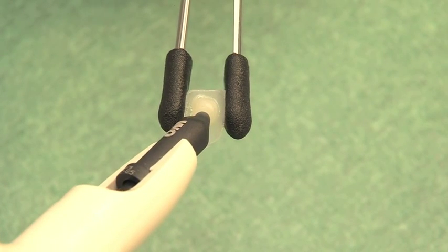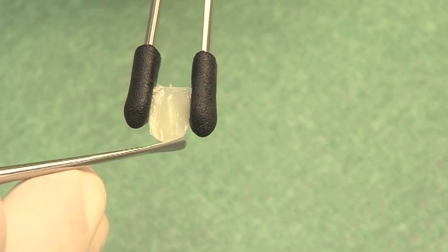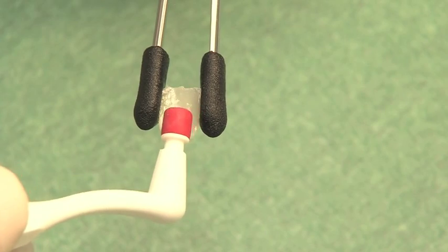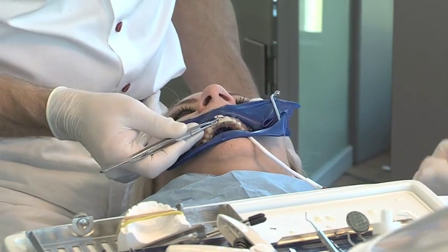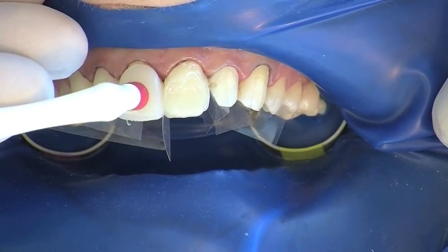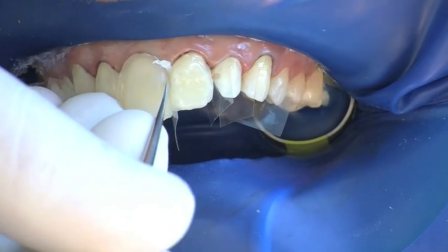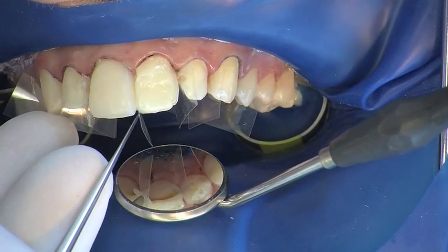The luting composite is also applied to the Componeer in order to avoid air inclusions. Exact marginal adaptation is important. The first Componeer is placed on the tooth using a pair of tweezers. The placer with its silicone attachment enables even pressure to be applied which does not vary in direction. Excesses are removed by cutting with a specially designed spatula and the composite is adapted exactly to the marginal areas.